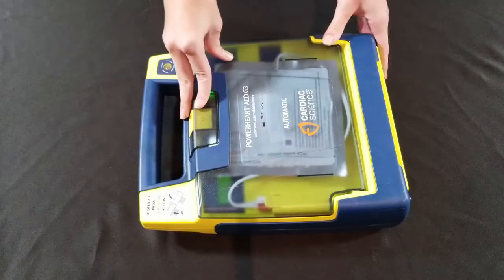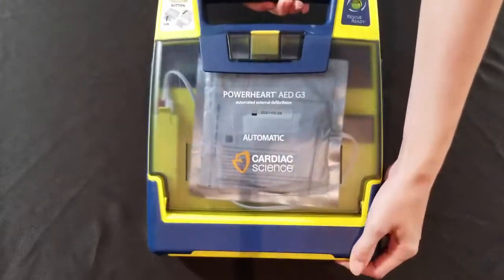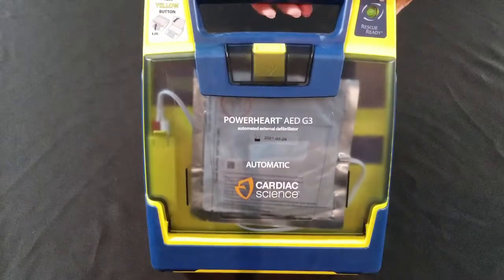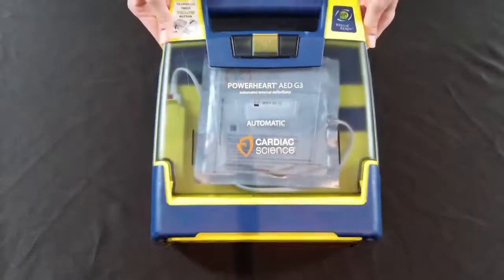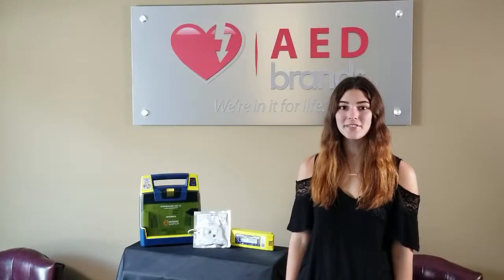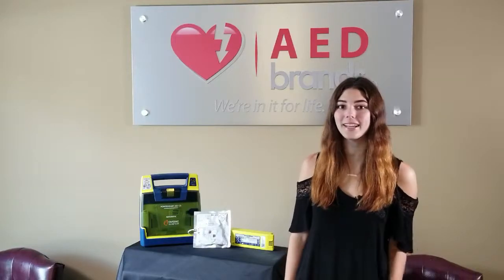As soon as it starts talking to you, you can close your device. Your rescue ready light should then turn green. If it doesn't, give us a call and we can help you with tech support. Now that you've replaced your battery and pads, your device is rescue ready. We hope you found this video helpful — if you have any further questions, give us a call because we're in it for life.